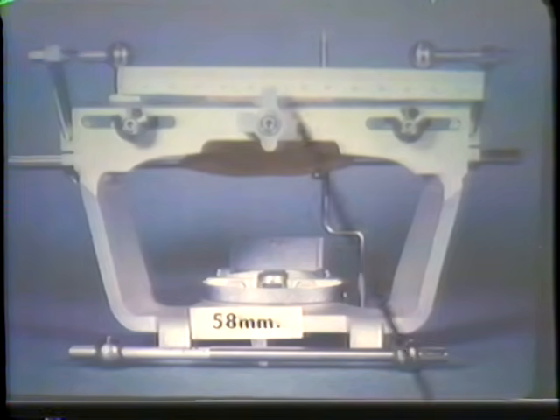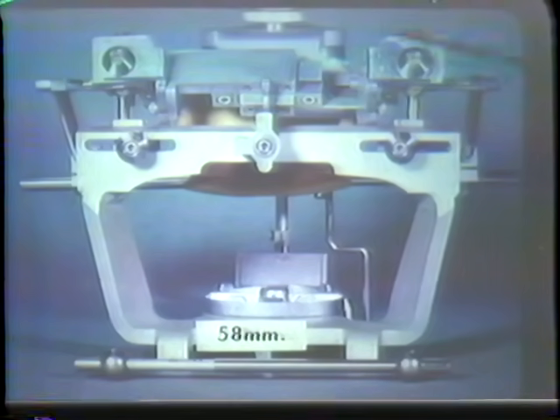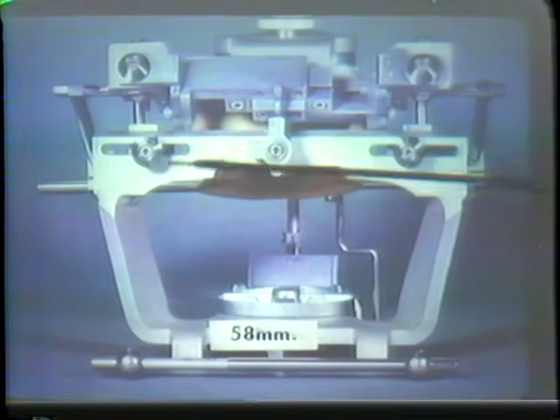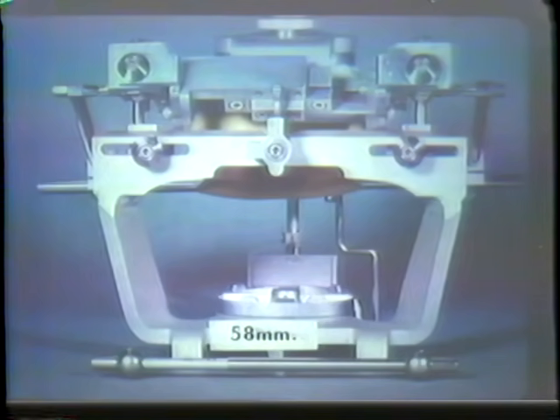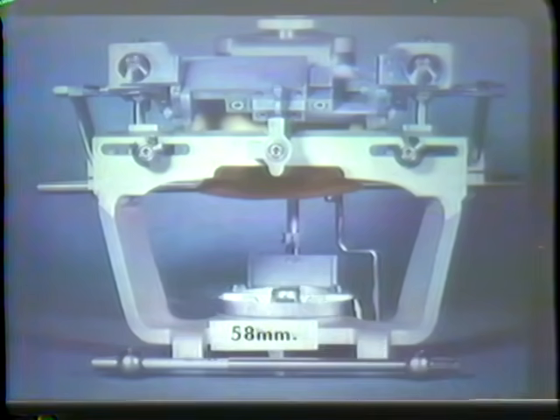So we adjust the instrument to that, and then the upper member is also adjusted to it. So now we have one at 116 instead of a standard width, an instrument which does not have this feature of adjustment out and in. A number of these are made without this adjustment, and they're about 110 millimeters as a rule. So this is another feature, a refinement, as far as the vertical axis location on the instrument, as you might have, or you do have, in the skull in respect to the mandible.